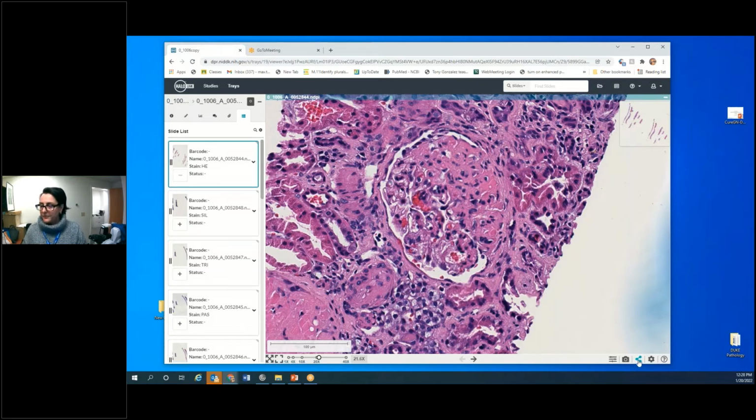I will use this function, which will create a link, and this link can be copied into the CureGN core scoring CRF as documentation of what used to be the annotation that was done by dropping a pin and then typing the level and the image where this was found, etc. So this is now a 2-click annotation, and the annotation will be in the CRF and will now be visible to any other pathologist who opens this image.